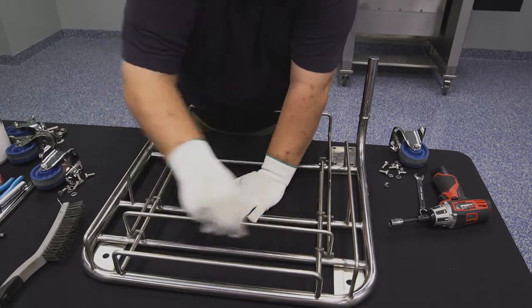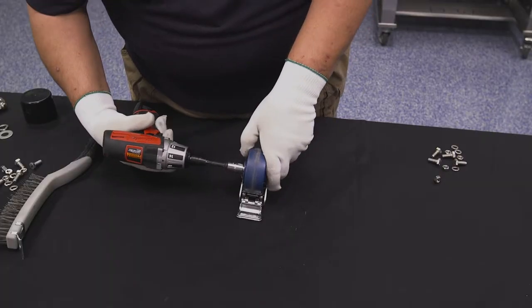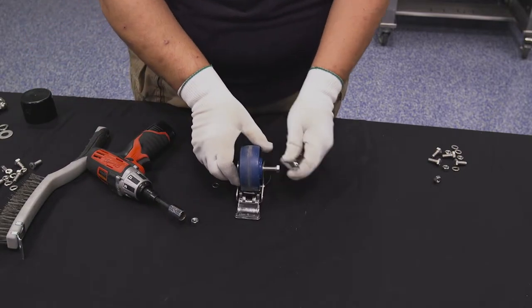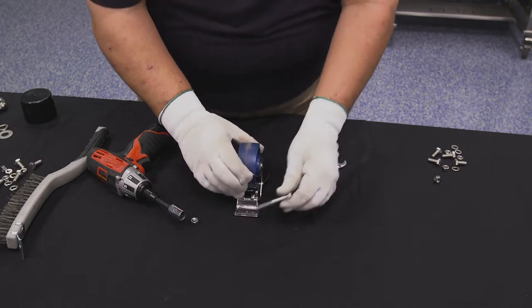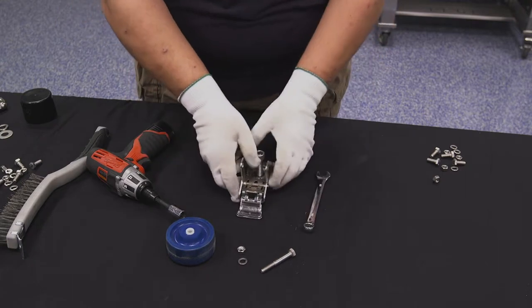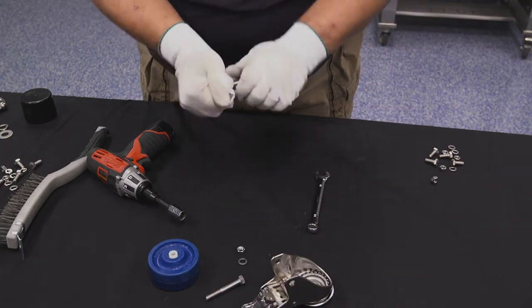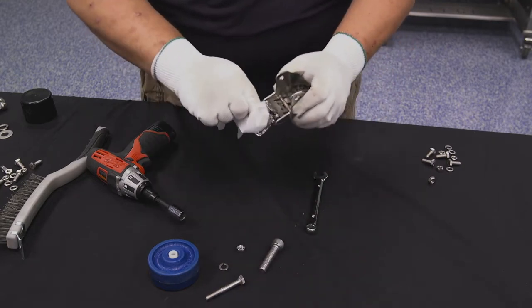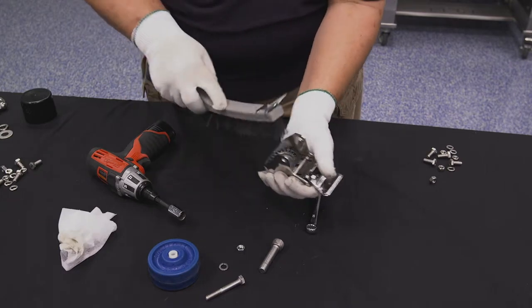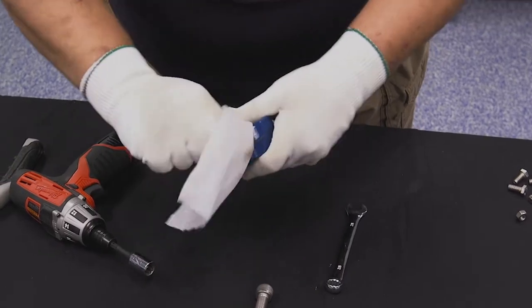If you plan to continue using the existing casters, disassemble them for cleaning in the following manner. Hold the axle shaft head with a 1/2 inch wrench or channel lock pliers. Remove the nut with the 1/2 inch socket. Remove the star lock washer and axle. Remove the wheel from the fixture. Clean all parts of the casters with a pre-saturated wipe to remove contamination and chemical residues. Use the stiff wire brush to clean the bearings and other hard-to-reach areas. Clean the rolling surface and sides of each wheel.